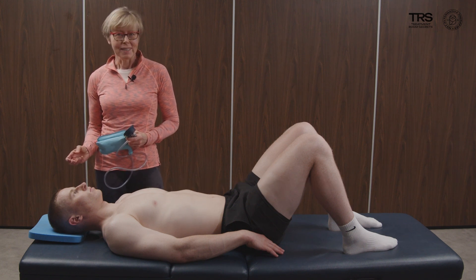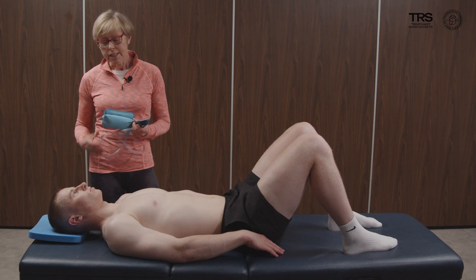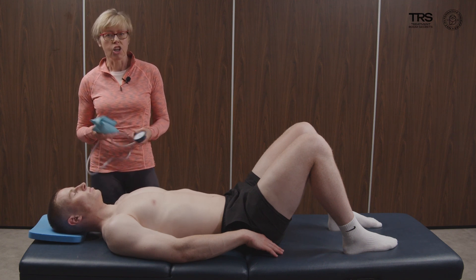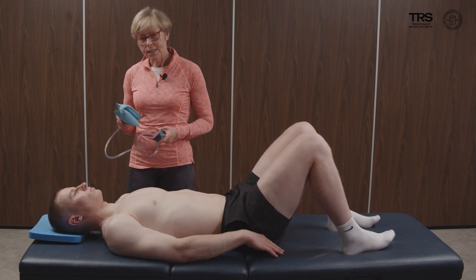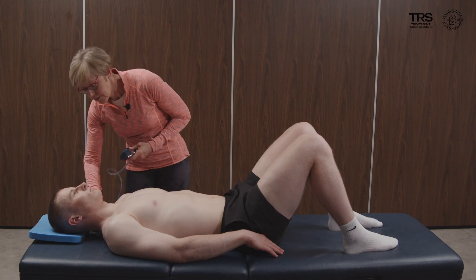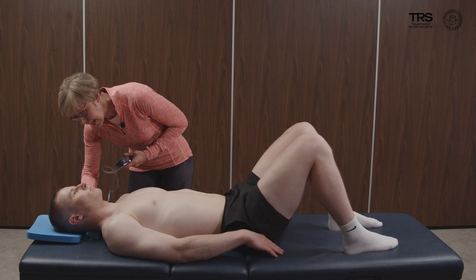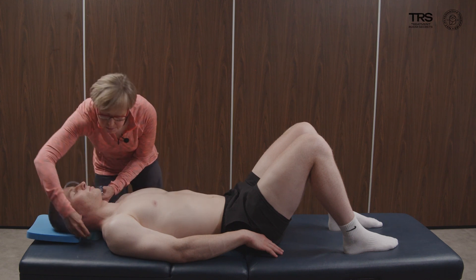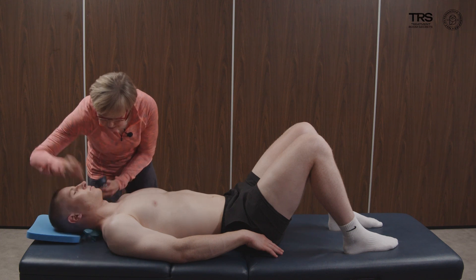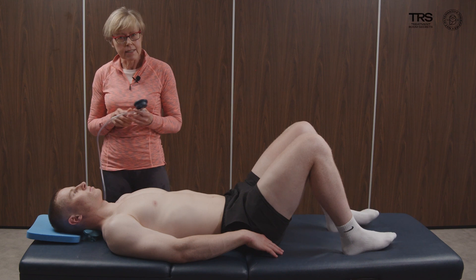Some older people particularly might need more of a raise underneath the head, in which case you would include a little bit more raise underneath the neck as well correspondingly, because what we want is for this to fill the space between Jack and the couch. So if I can just slide this underneath your neck — it's going into the hollow of the neck — and we'll make sure it's nicely positioned so that he's in the middle of it, then give it a squish to make sure the air is evenly distributed.